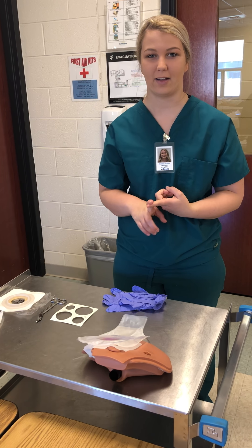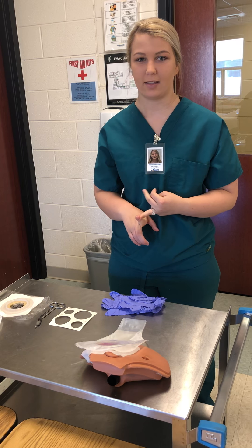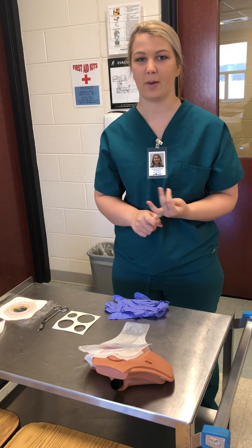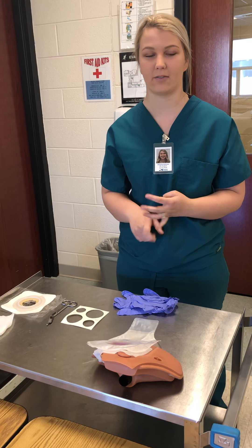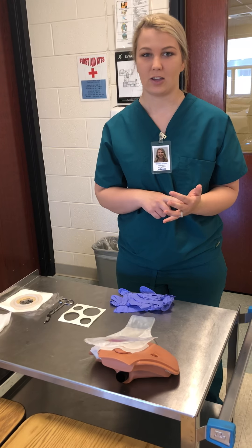Care, co-wipe: check orders and allergies, assemble the equipment and assess the patient, wash hands, don gloves, introduce yourself to the patient, identify the patient with two identifiers, provide for privacy, explain, educate, and evaluate.